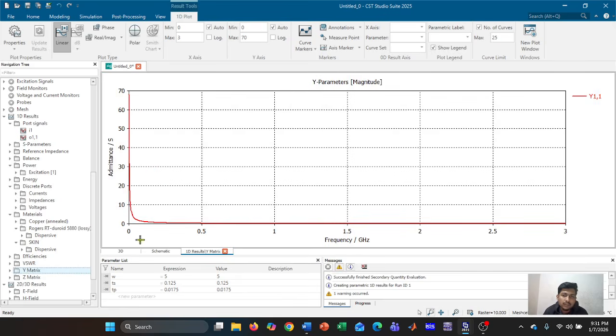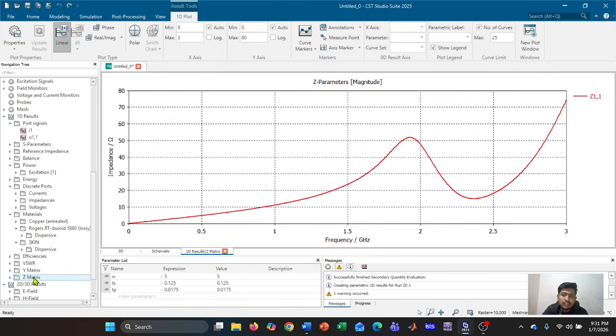This is the Y matrix, parameters, magnitude with frequency domain. Useful for circuit designers, not critical for antenna performance discussion. See the Z parameters. This graph shows antenna behavior in terms of voltage and resistance. This peak shows where the antenna resonates. It again confirms the antenna's working frequency.